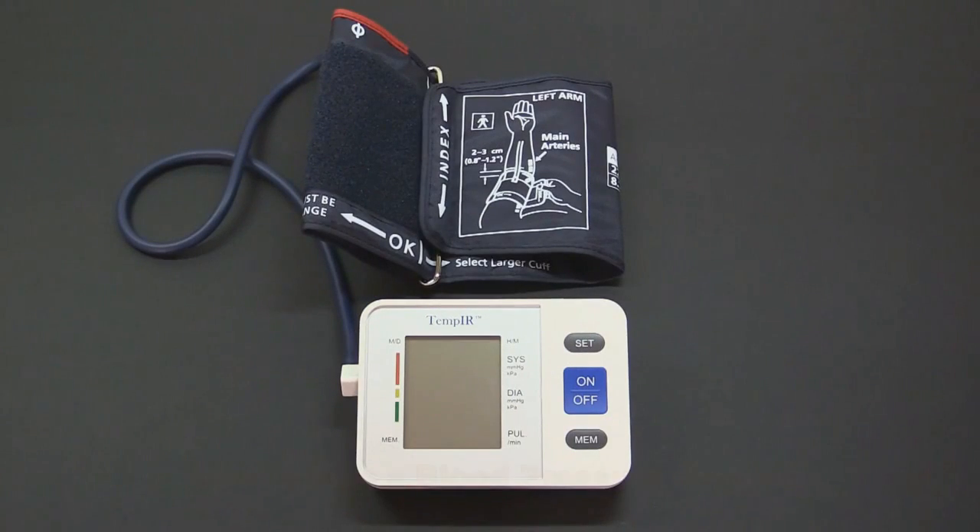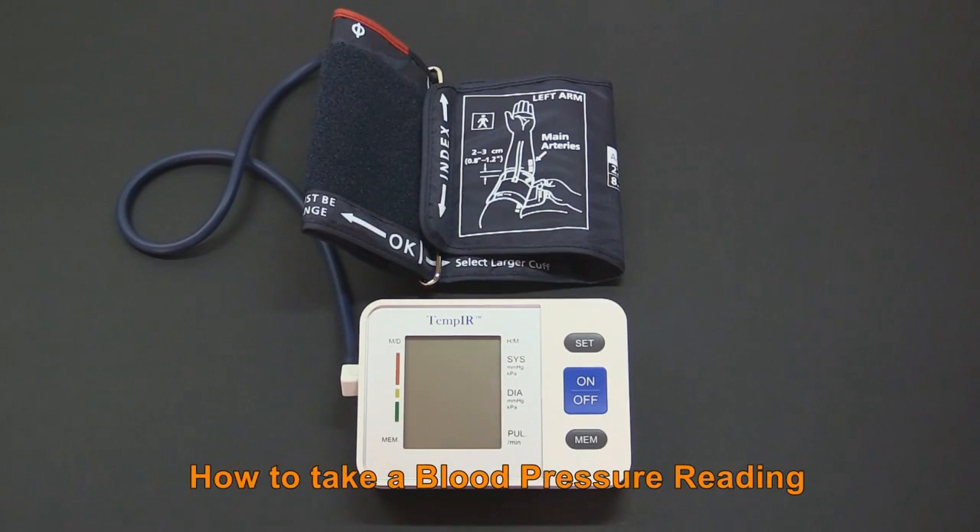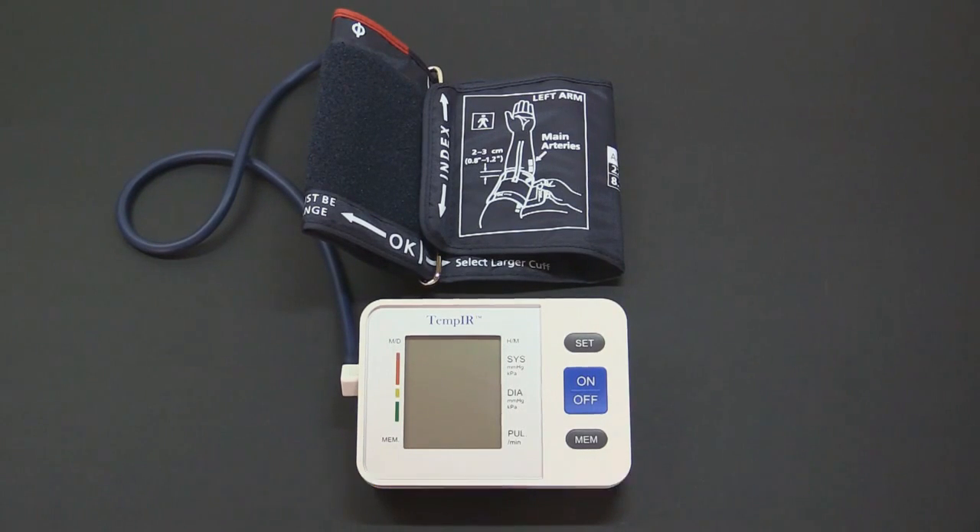The Tempi-R Upper Arm Blood Pressure Monitor can easily be used at home to both monitor and record systolic and diastolic blood pressure as well as pulse rate.